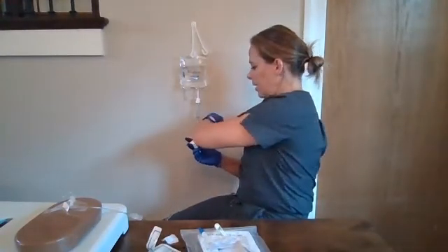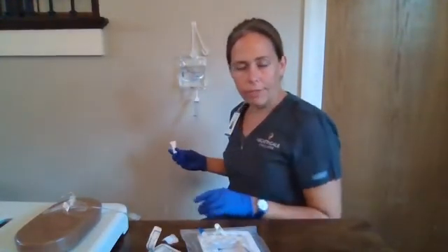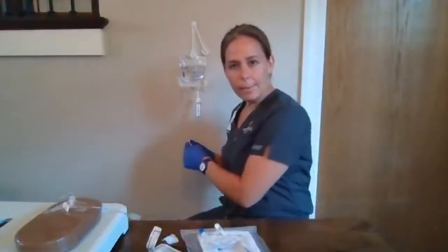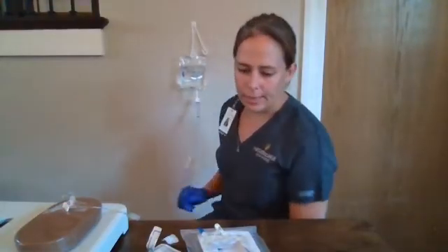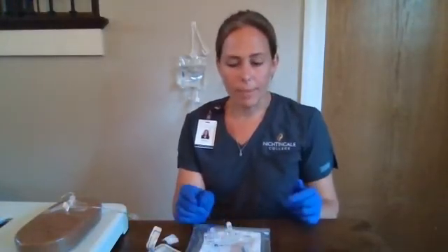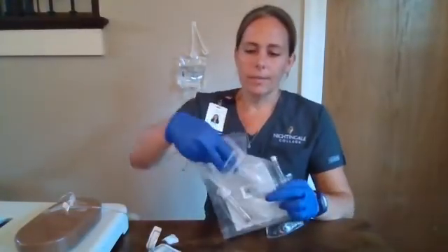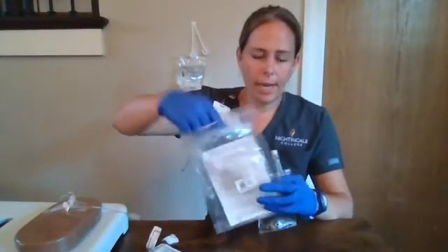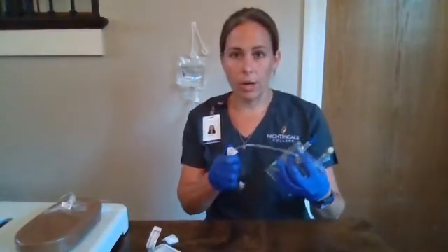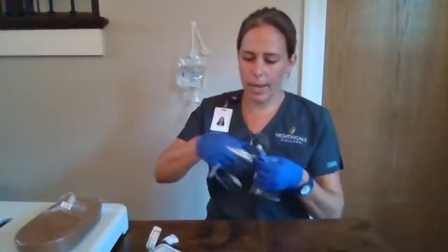Okay, we are at 38 drops in one minute. In the real world I would allow this infusion to continue, but due to limited supplies I'm going to pause this infusion and we'll set up our IV piggyback. So we have our amoxicillin and our secondary line — again we want to make sure that our line is closed when we spike our bag.